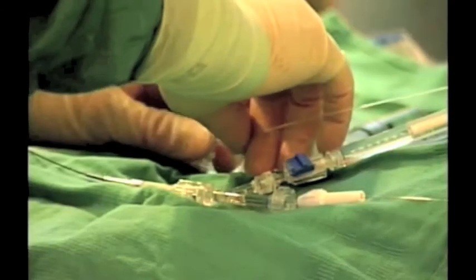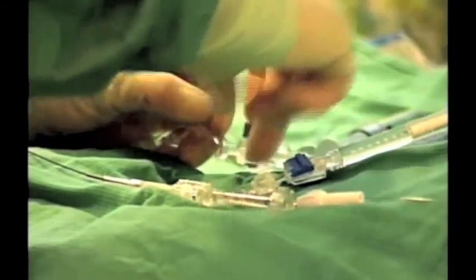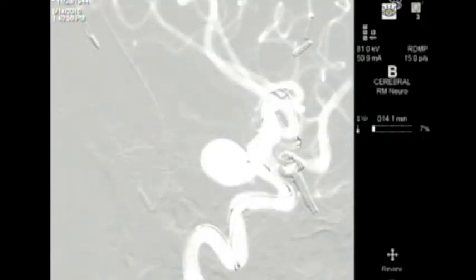The coiling procedure is performed in a state-of-the-art biplanar angio suite. The microcatheter tip is delivered into the aneurysm.